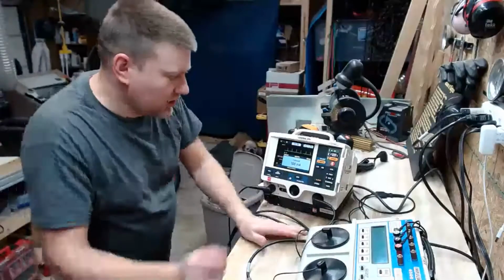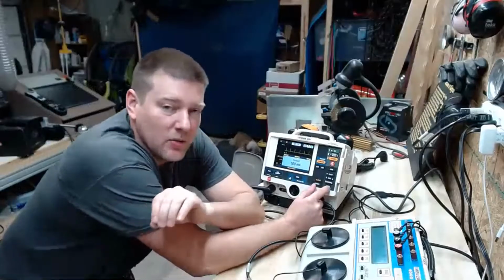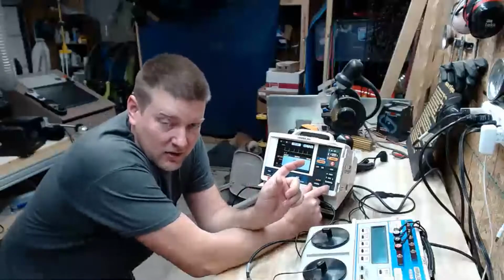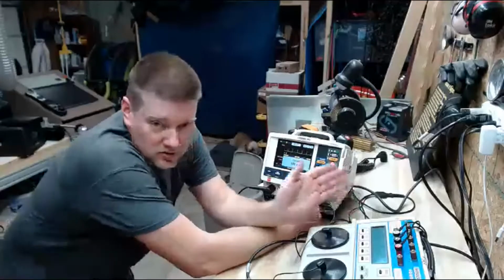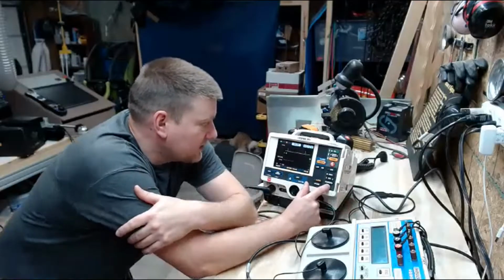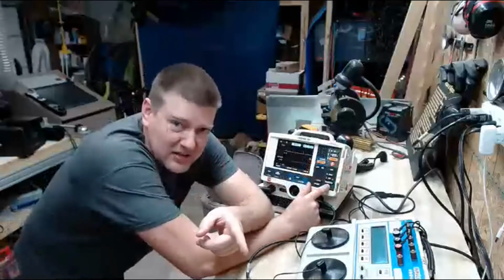Now the other things to do, over here, you have a pause button, and in some defibs, you have a 1 in 4 button. What it does is it allows it to stop pulsing so the doctor can get a quick glimpse at what the heart's trying to do, or if it's just failing completely. So we press pause, and you see how it does one beat, and then it goes for a period of time, and then another beat, because your heart still has to beat.